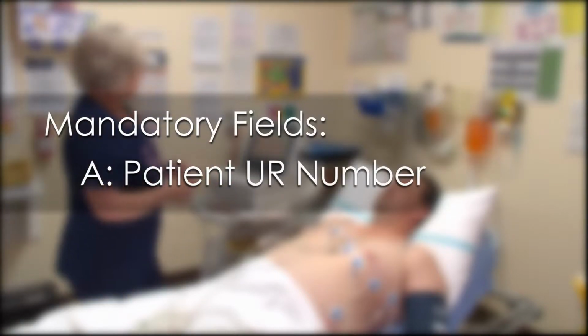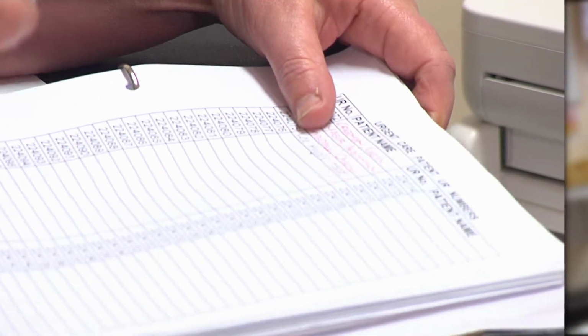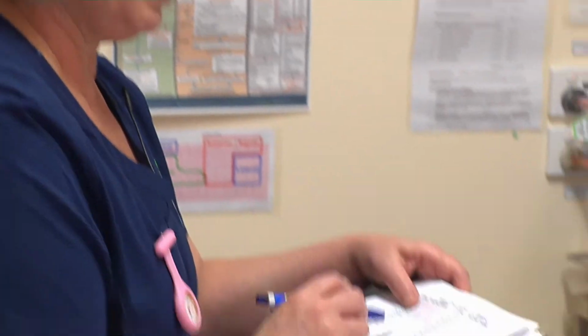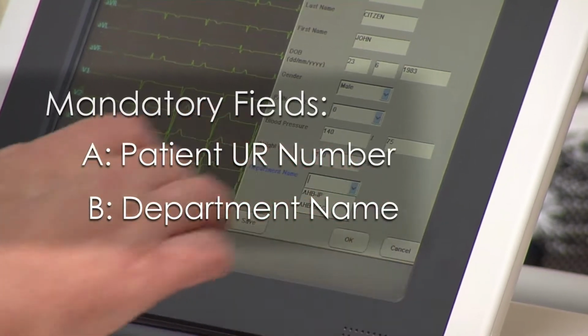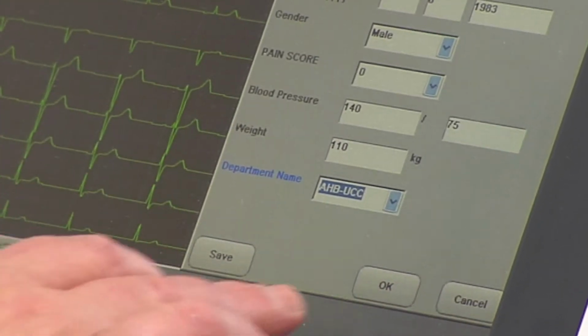The patient UR number. If the patient has previously presented at the urgent care centre, simply retrieve it from their file. If the patient has not previously presented, a UR number must be allocated to enable the transfer of the digital ECG. Have you been a patient here at this hospital before? No. Okay, so I'm going to give you a UR number and that will be your number for this hospital, okay? And the second mandatory field is the department name. And we put in our department, which is Alpine Health Urgent Care Centre.